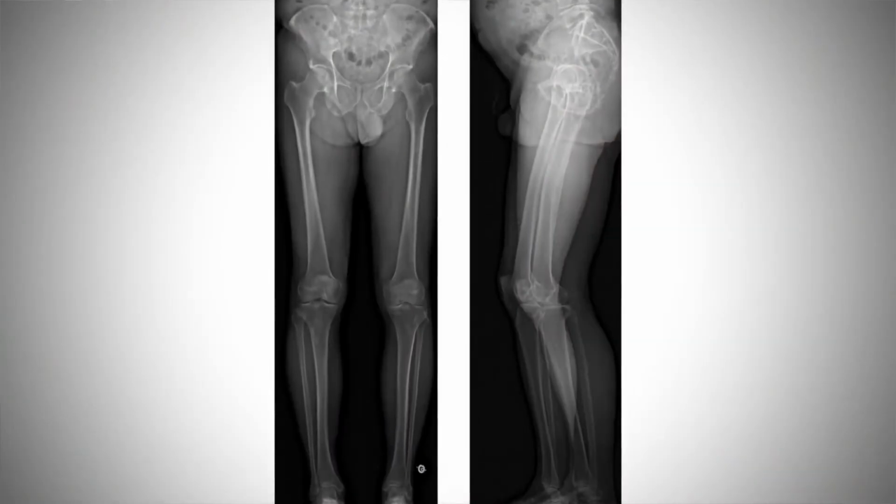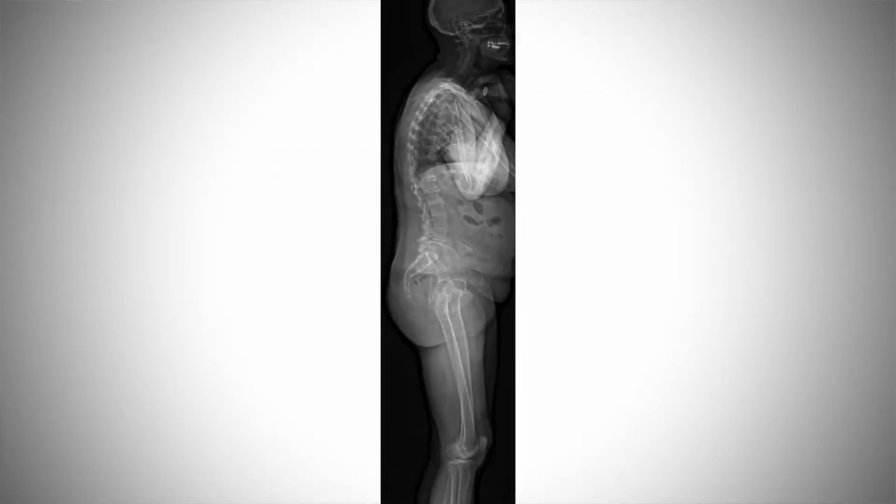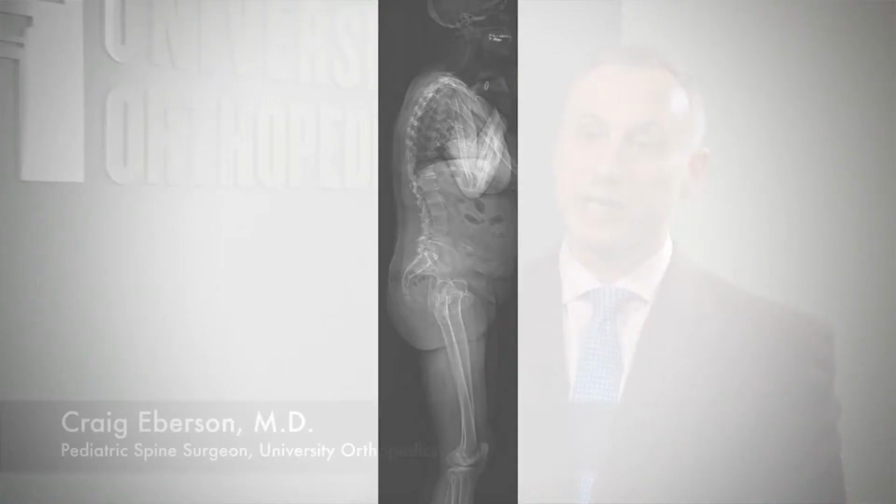deformity. In the adult spinal deformity world, we know that often patients have arthritis of their hips and their knees, and that affects how they stand. So the x-ray that you get of a patient's spine standing up may only give you part of the story if you don't have the ability to scan their whole body. And we've seen our spine surgeons actually change how they approach the surgical management of those patients and get much better results. And then it goes into the world of adult reconstruction.